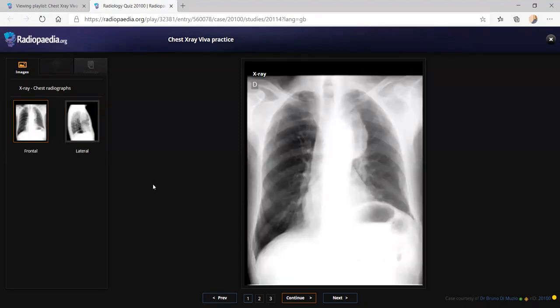So you are taking back your statements from the frontal projection? I'll rephrase myself because I'll not take back the statement from my previous interpretation. I'd still like to consider the possibility of a mediastinal lesion. If it is a mediastinal lesion, in which compartment of the mediastinum? Anterior mediastinum. If it is an anterior mediastinal lesion, I'll think of the possibility of lymphoma, thymoma, or a germ cell tumor. I'd like to go for cross-sectional imaging for better characterization of the lesion and suggest discussion at the chest MDT.